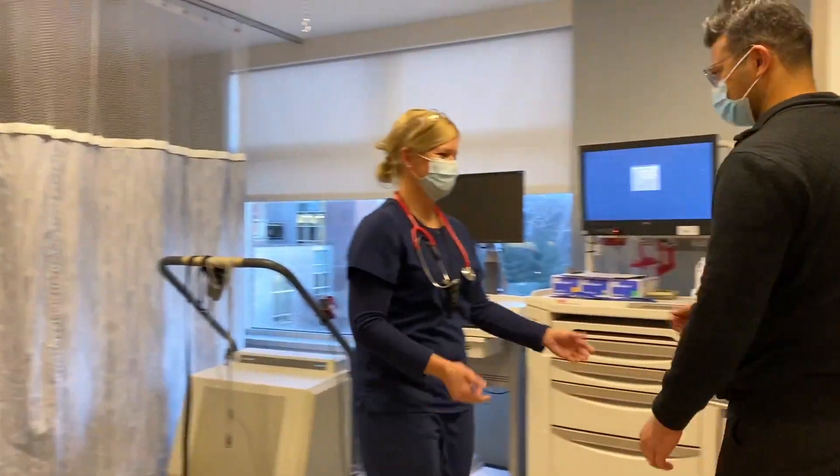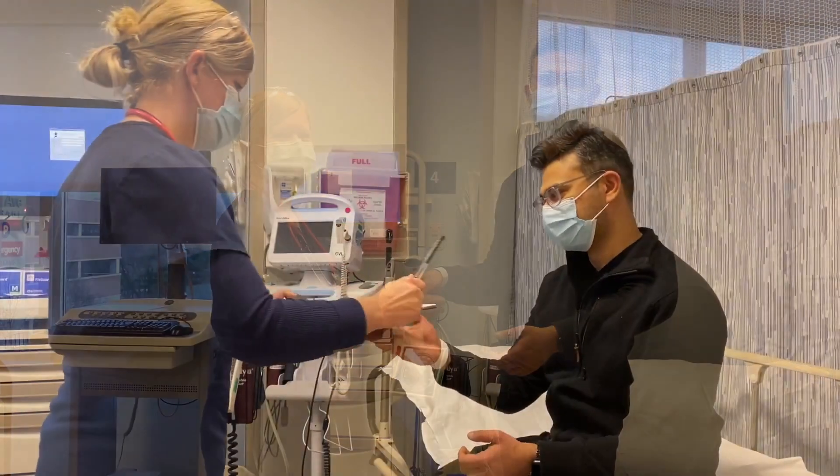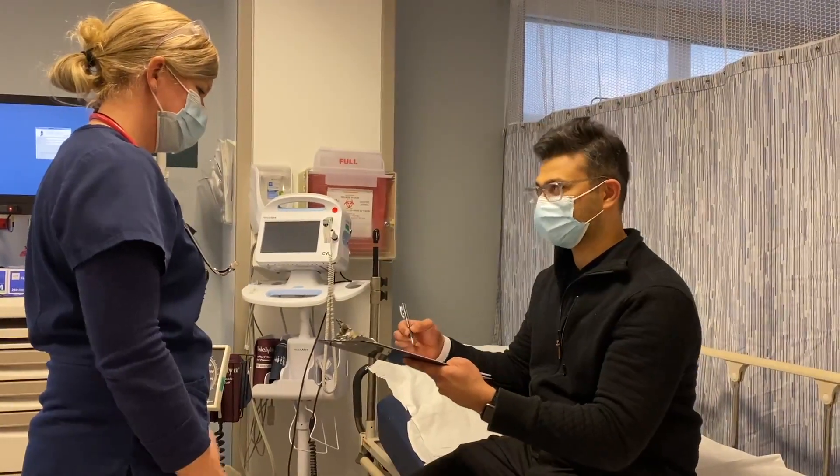When you first arrive at the stress lab, a nurse will be there to check you in. Once you are checked in, the nurse will explain briefly what kind of stress test you will be receiving, and the risks and benefits of the procedure.